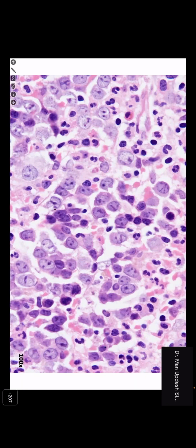But many of these, if well oriented in the way we want to see them, you will see the transverse elongated nucleus attached to the membrane. If they are cut like this, obviously these nuclei will be seen as a dot. So that's a soft pointer there that they might be erythroids. And then the cytoplasm is more amorphous. Sometimes the genuine myeloid precursors might start showing dots, the later type of blast where the granularity appears.